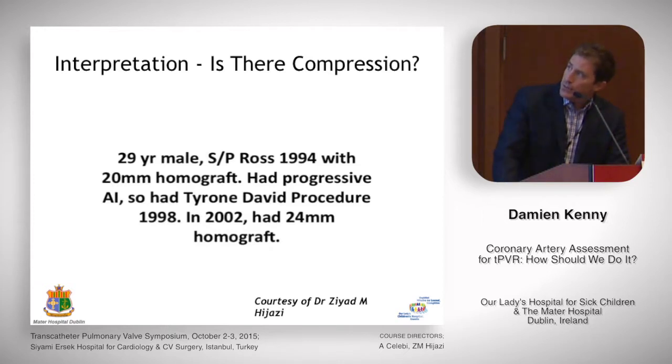And what we'll see is that with the balloon inflated, it's probably a little bit distal there. You can see that there's good filling of the left coronary. But again, with all of that calcification, the suggestion is that the conduit is a little bit close to the left coronary. So we pull the balloon back a little bit more and have a look again. Again, the left fills well. One of the issues is, again, if it is towards the ostium, one of the problems you may see is that your catheter is actually beyond where you may get some of the compression.